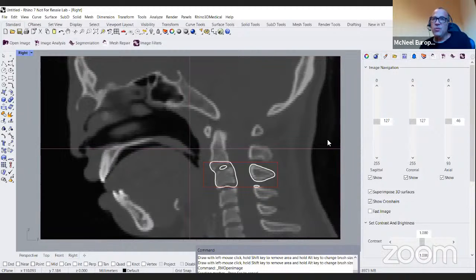Biomedicine now. Hey, Pablo, cool workflow. In order to fit the surface of the guide onto the bone, you need to ensure adequate soft tissue clearance. Is there any way to estimate that? The only way is through the CT. Maybe some collision detection there.